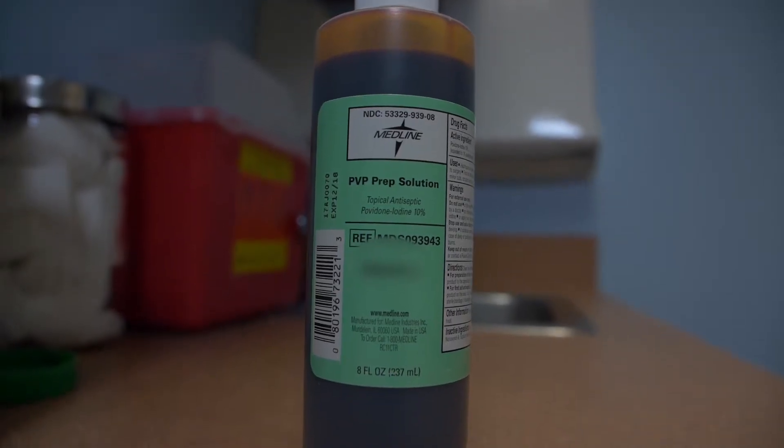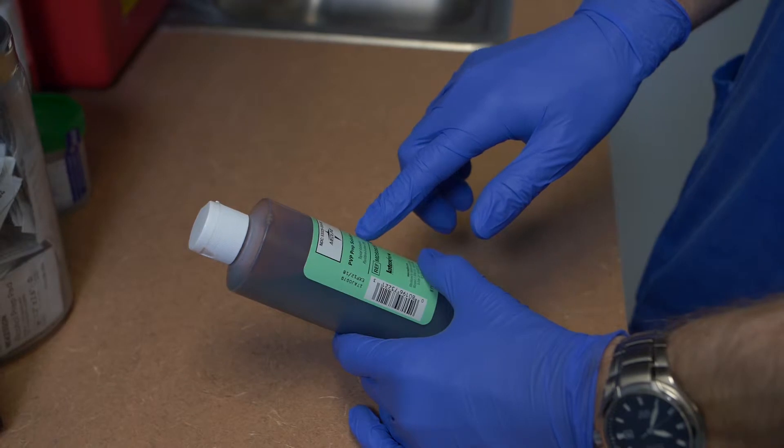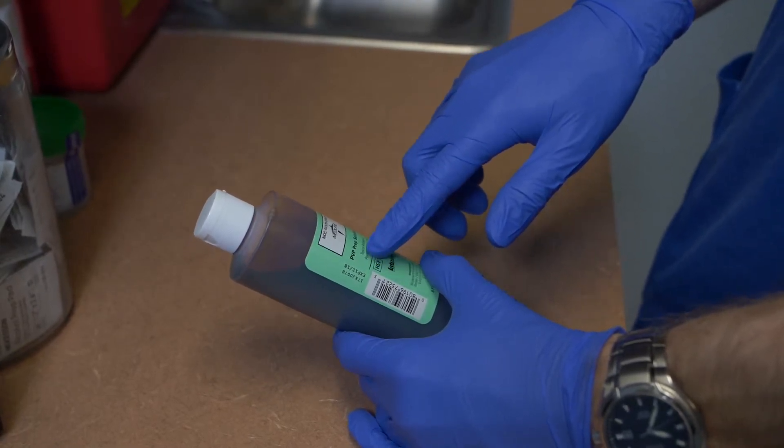Read the label of the solution container three times to ensure that you have the right solution, and check the expiration date.